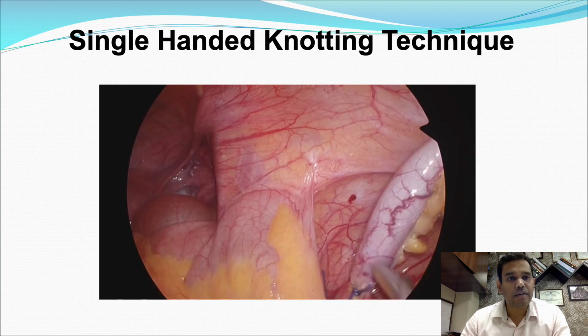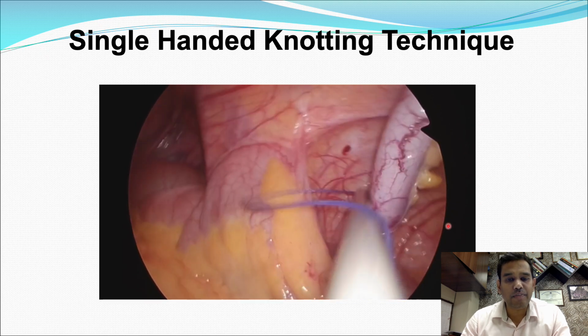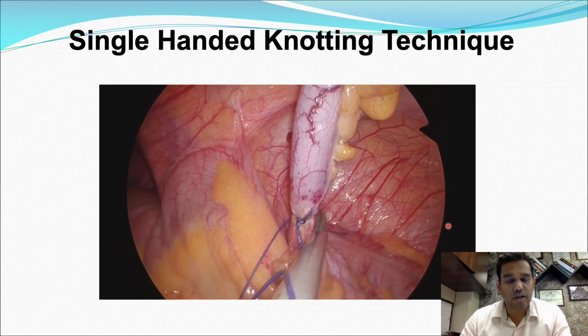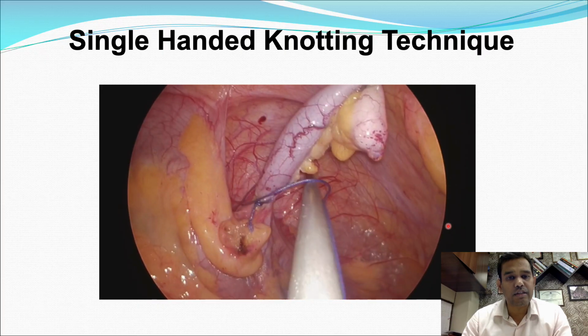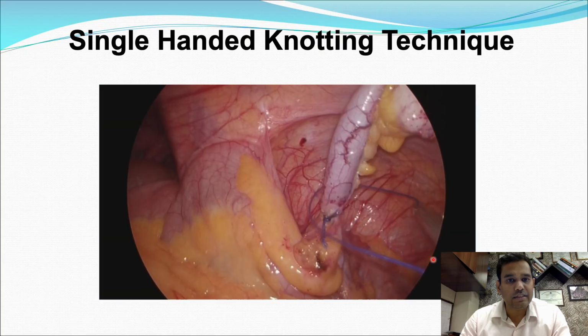This is an example of a single-handed knotting technique. If you don't have an additional port to hold the suture or take the knot, then you can use single-handed suturing. The prerequisite for this type of suturing is that you should have a long length, at least 100 centimeters, of suture. The other end is outside the abdomen.